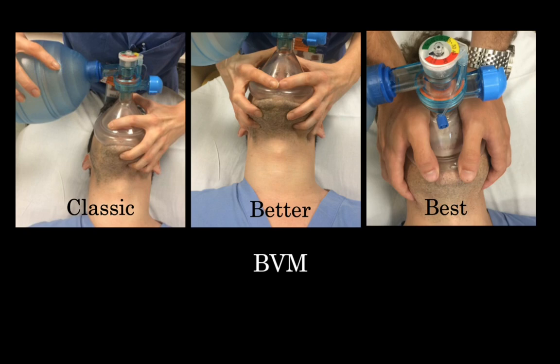Why this is the best is because what it frees up is all 8 of your fingers to get under the jaw and pull the jaw up into the mask. What we want to do is pull the jaw into the mask, not necessarily shove the mask down onto the face. With my 2 thumbs resting on both sides, I have nice equal pressure of the mask over the face, and I have all these fingers free to give a nice jaw thrust.